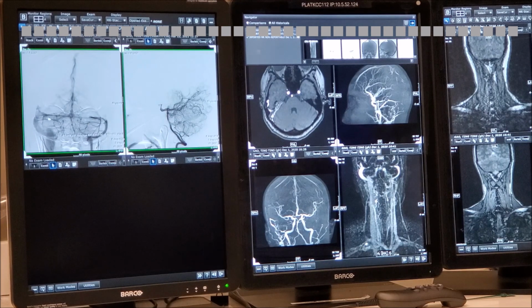Here we have a big sigmoid, big jugular, but we're not seeing the transverse sinus. On the opposite side, what do you see? A slimmer sigmoid. Yeah, smaller. There's already some non-opacification. Well, it could be hypoplastic, it could be developmental in nature. Now, look at the density of contrast here. There's dilution. So I cannot say if this is thrombosed. This could be just washout.